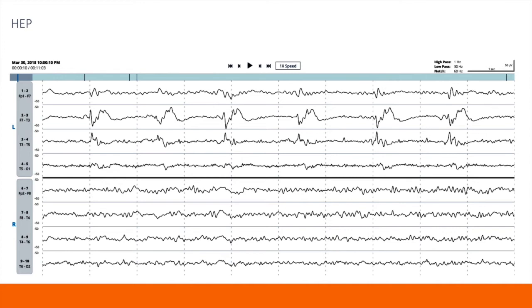In this particular patient, the left side of the brain is irritated and is producing these sharply contoured discharges that we call epileptiform. Again, epileptiform because you have this up, down, and then a slow wave afterwards. They are happening in periods of time. Almost every 1.5 seconds, you are seeing one discharge being generated. Therefore, it is periodic. This is a highly epileptiform pattern that will need your attention. And if you listen to it carefully, it is not very repetitive or continuous, but yet it is periodic.